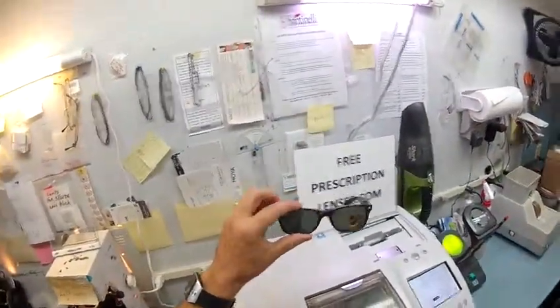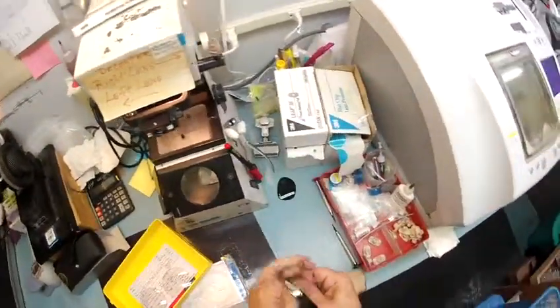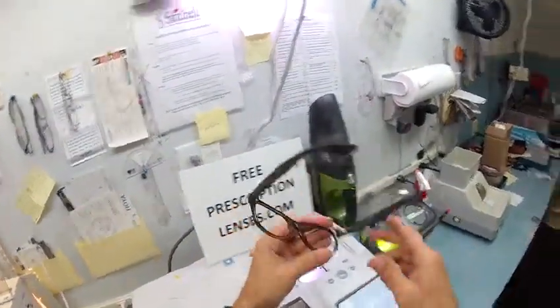This is your frame as it comes to me with the heavy glass lenses. I'm going to pop those out. Get those heavy glass ones out. The weight of your frame just was cut in half. But let's go ahead and get started.